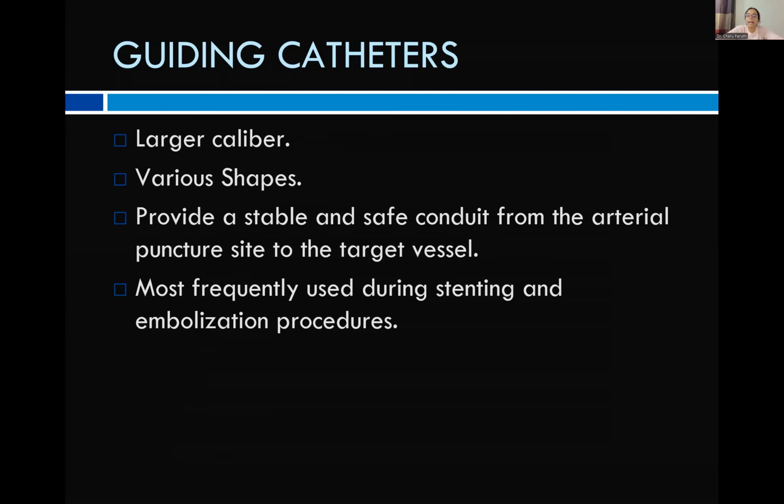So next we have guiding catheters. These catheters usually they are not used for just taking a diagnostic angiogram. The difference is that for the same French, the same outer diameter, the inner diameter of these catheters is wider. So they are used for guiding other instruments through them. Themselves, they cannot hook different vessel origins. So they are put in place once the guide wire is already there and has already been taken there via a diagnostic catheter. Diagnostic catheter is taken out and guiding catheter is then put in place. And then through the guiding catheters, other instruments can be put.